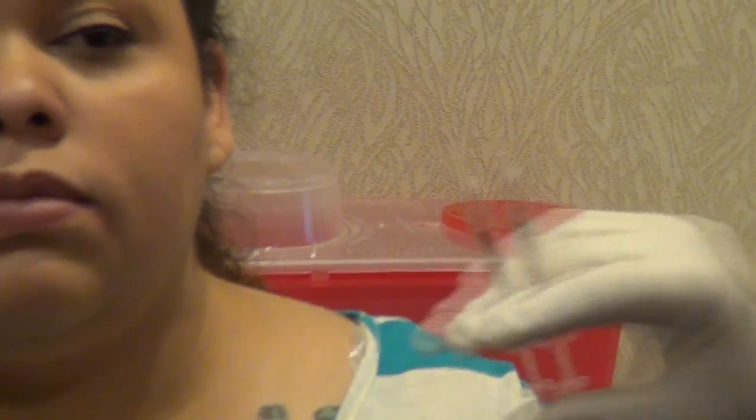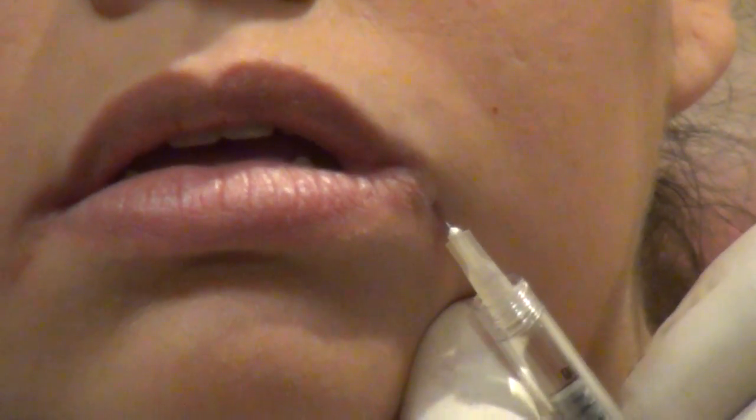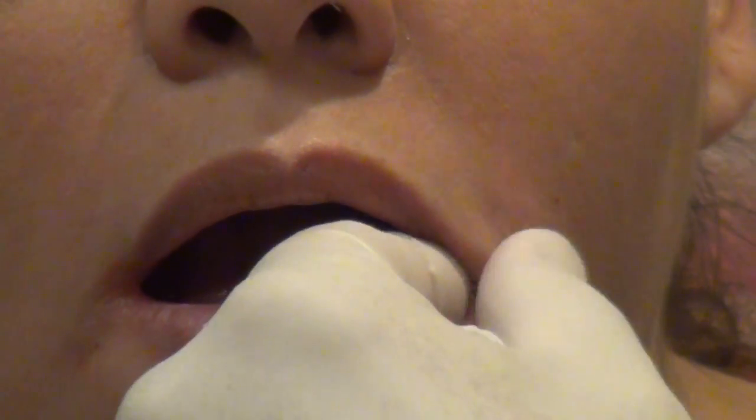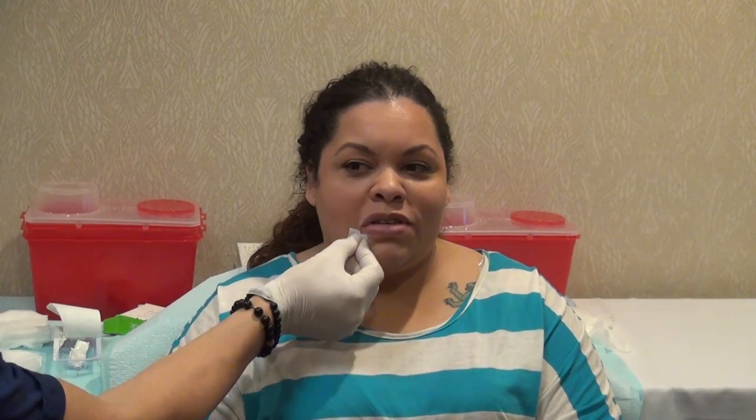Any questions? We're going to be practicing this right now. Botox is a great procedure, but you don't get to see the patient's reaction right away — you have to wait. With fillers it's so immediate, they're usually very happy. How's the pain? She seems to be tolerating it pretty well. You can feel the initial stick and then you feel it plumping, which is a bit of an odd sensation. At this point the whole corner area of my mouth is totally numb — this product has lidocaine in it.